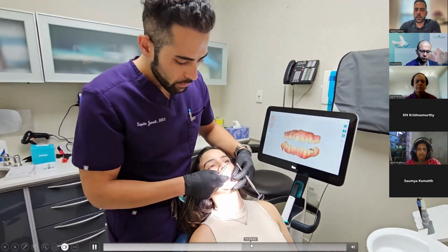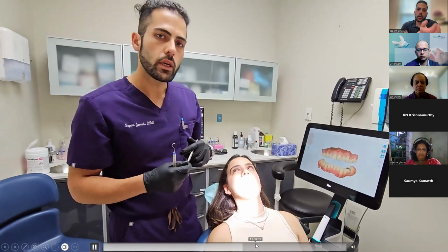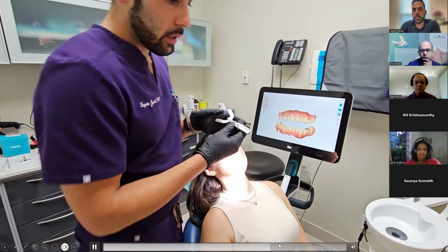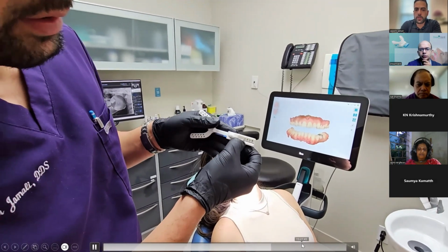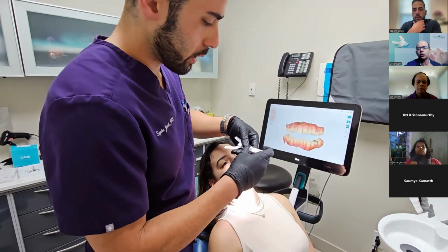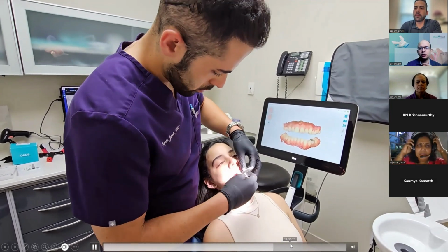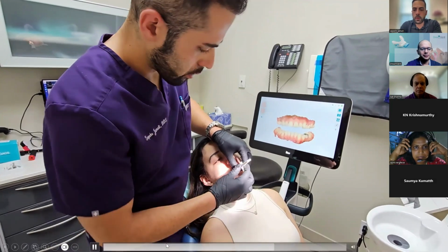the other means like the George gauge to accurately calculate how much of the maximum protrusion we can set the patient in. And I'm gonna ask George to send you guys these videos to see how to use the George gauge. Not every patient is gonna benefit. We also have FAQs prepared, so we can send them out so they can see how to use the George gauge.